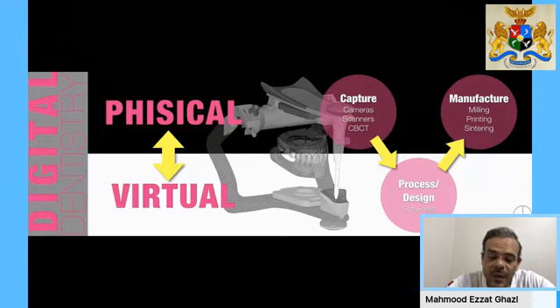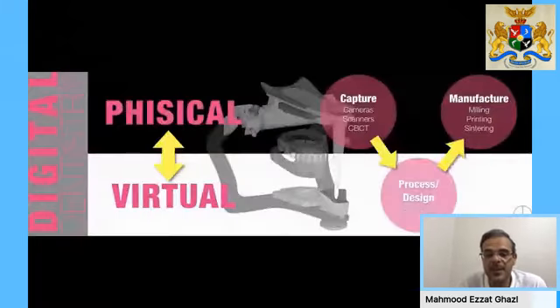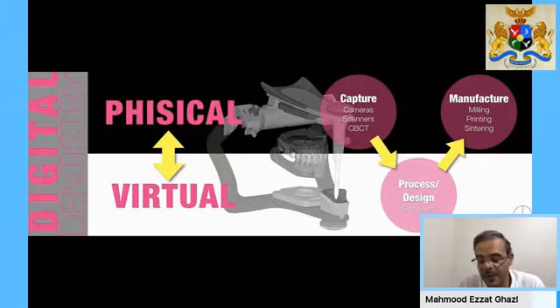Treatment planning also involves meeting your expectations with the patient's expectations and with your lab. It involves mostly the whole brainstorming process before you even start with the patient, so that you can give your patient a more predictable result at the end, because this is what our patients want from us. They want us to plan out their cases, take all the information needed, and deliver for them something that will live for a longer time, something that would look good, something that would function very well, and something that would be biologically, of course, acceptable and pleasing.